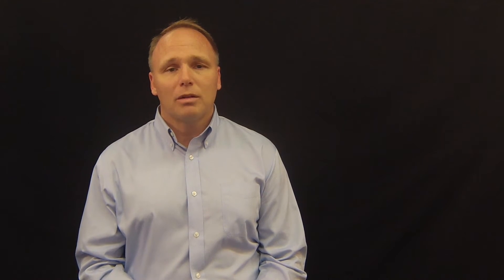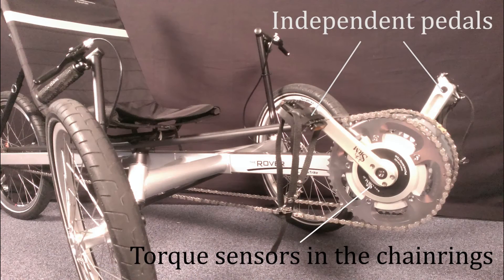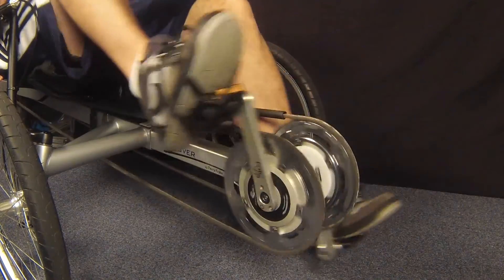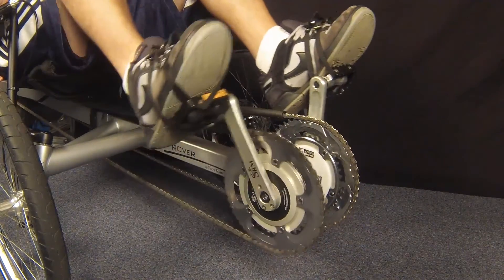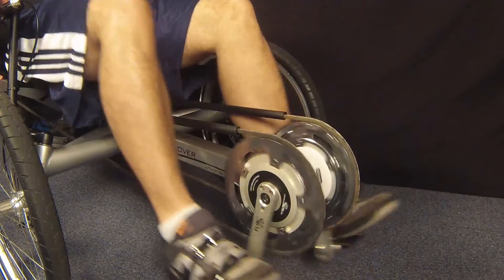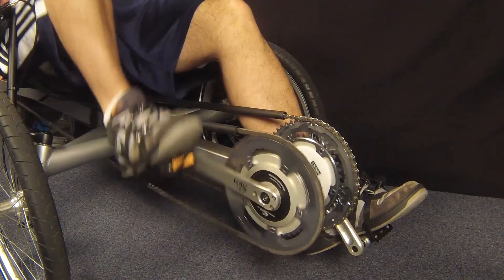Large populations of people have gait asymmetries due to conditions such as Parkinson's disease or stroke, to name a couple. We have developed a unique mobile cycle where each leg is completely decoupled and we can independently measure power and cadence from each limb. With this test bed we are focused on cycling produced by the stimulator alone, the stimulator with a motor to move the pedals during certain phases of the cycle, or with the best efforts by the rider along with the stimulation.